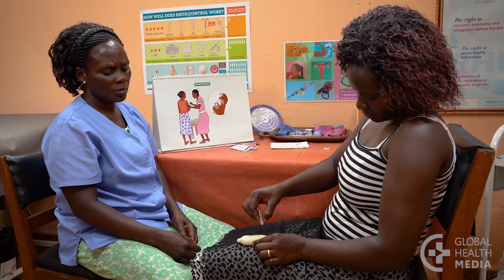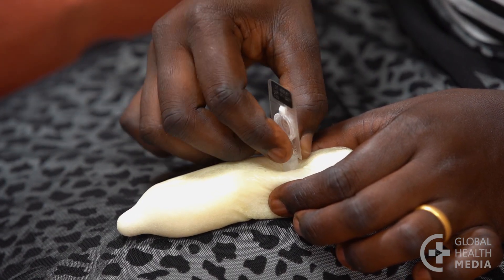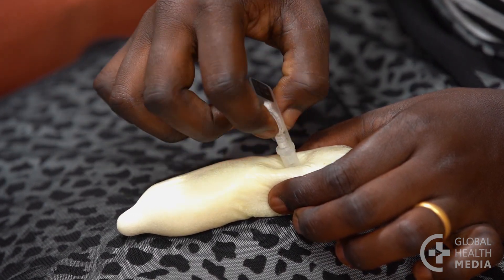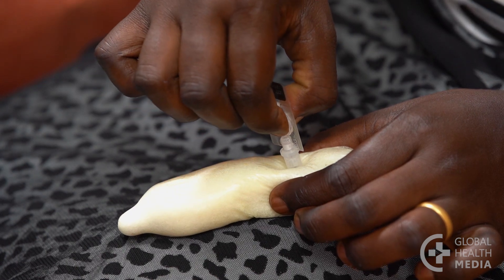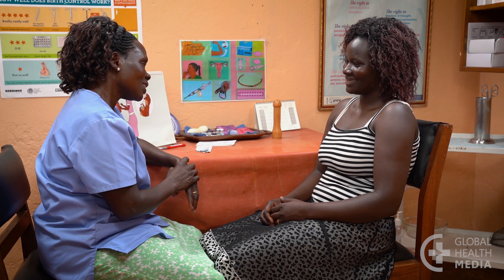Have the woman practice injecting an empty device until she is comfortable with the technique. When she is ready, have her carry out the steps herself with your guidance and support. Assure her the injection is not painful.